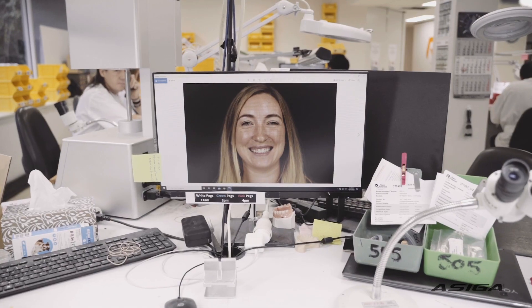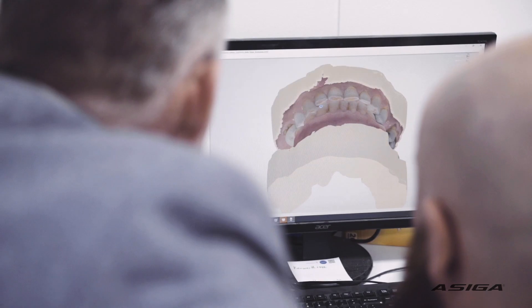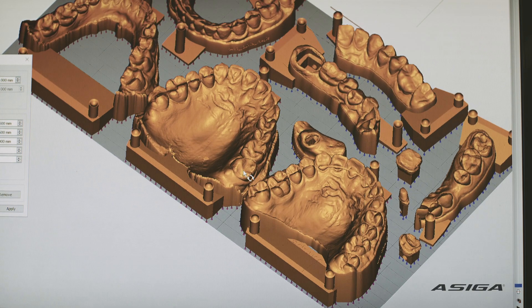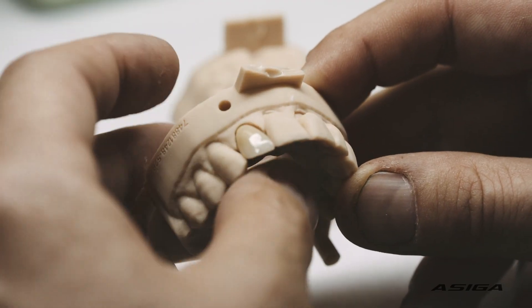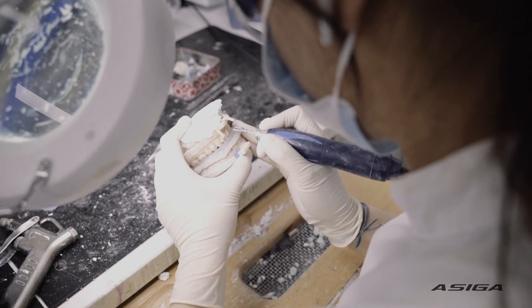A patient will see his or her dentist, who will take an impression. The impression is taken digitally. That file is received in the lab. We manufacture the restoration by reductive technology, or milled. And the model is 3D printed — that's where we get our accuracy and our consistency from.